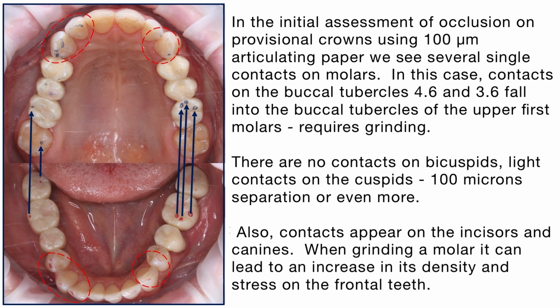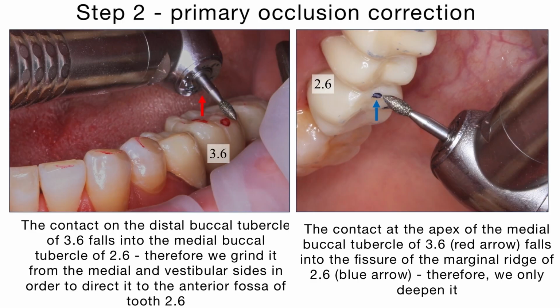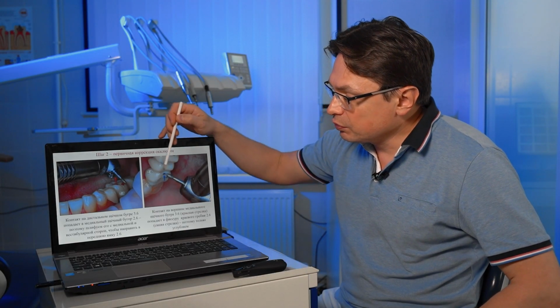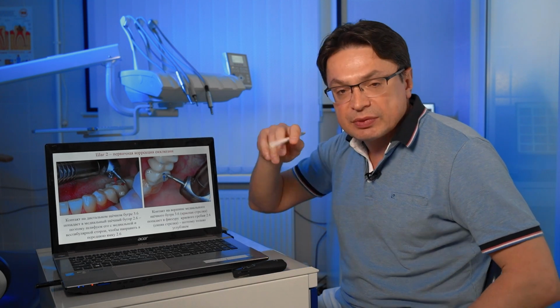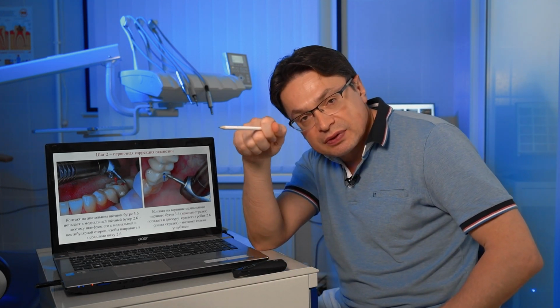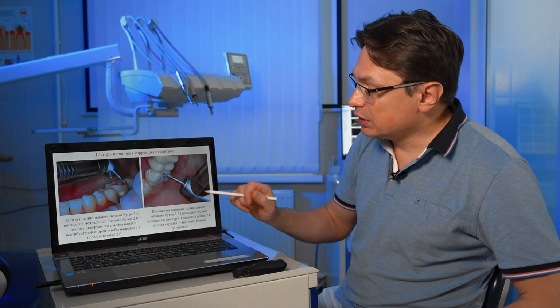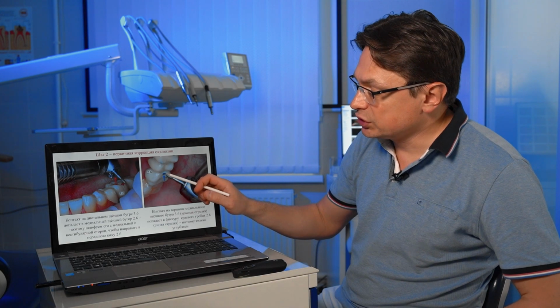So I start grinding. For grinding I use special burrs, the abrasiveness can vary. The only thing is when working with plastic, if you take a low abrasive burr, it will stick there. Therefore, we take more abrasive burrs but work carefully because we have to grind within the micron. If your hand trembles, then you can grind off the excess.